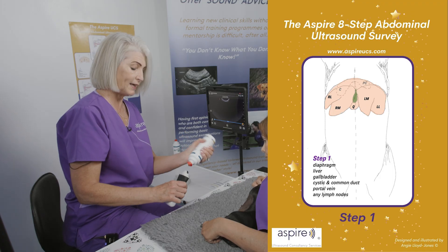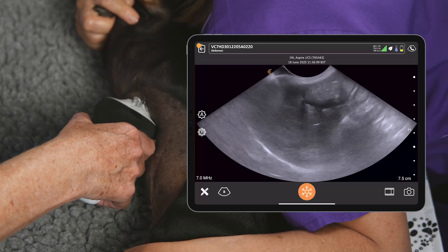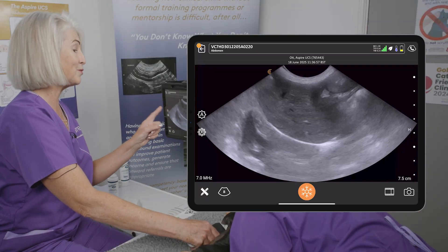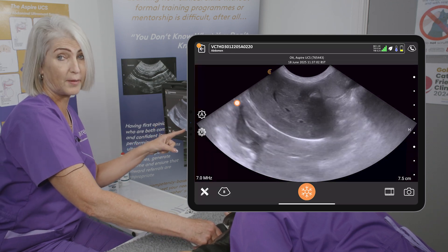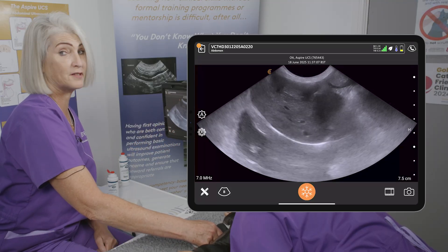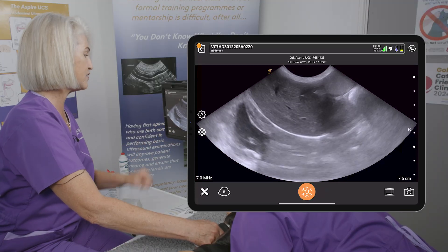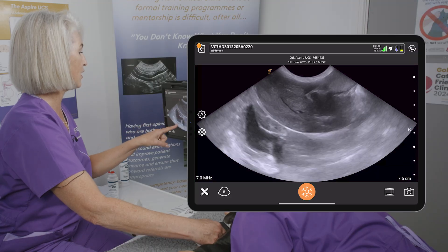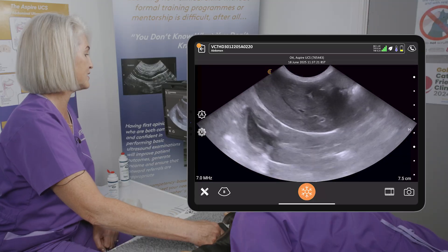Pop a little bit of jelly on, pop the probe on — sub-xiphoid in a long axis section in the midline of the patient. This is one of our favorites because we get a bicavity view, so we can see the mirror artifact this side of the diaphragm, which helps to prove that there's normal lung tissue there. You wouldn't have that tissue-mimicking liver the other side of the diaphragm if you had abnormal lungs or a pleural effusion. We can also see the heart, so if there was a big obvious pericardial effusion or a problem with the heart we should see that too.